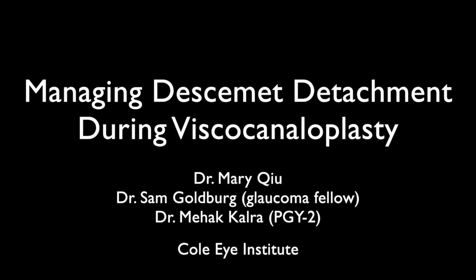This video demonstrates two different strategies for managing an intraoperative Descemet's membrane detachment during pressurized viscocanaloplasty.